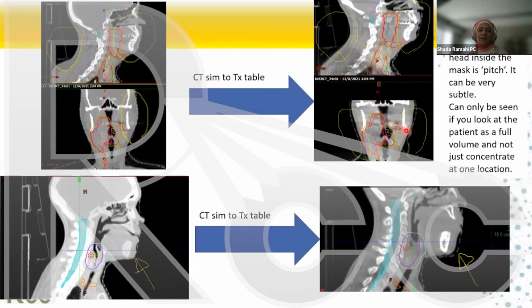The practice in North America is that for every stereotactic patient, when the therapists take the CBCT image, they call the physicist and they call the radiation oncologist. And we have to verify the position of the patient. What you don't want to do is be just looking at where the tumor is, because then you'll be missing the bigger picture. You'll be missing if the patient is well immobilized or not. You always want to start with looking at the macroscopic picture.